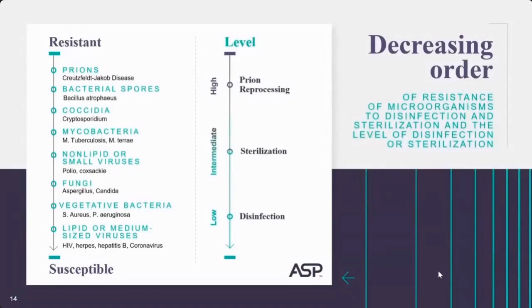Reprocessing guidance, as outlined by the World Health Organization, WHO, should be followed when instruments are used on a patient suspected of having CJD. And that could be another topic on its own.